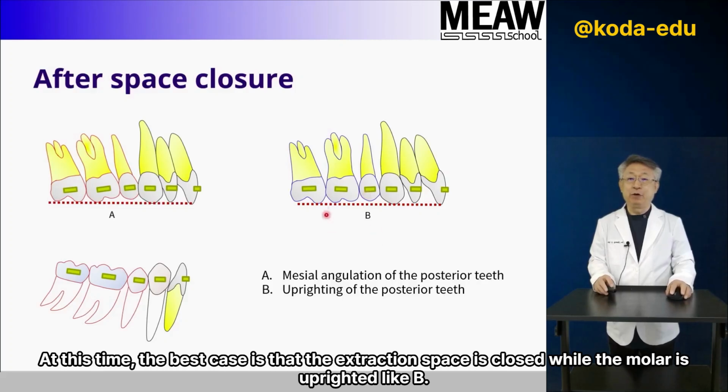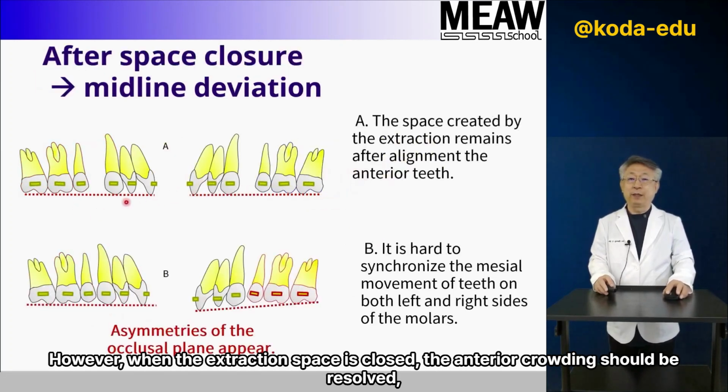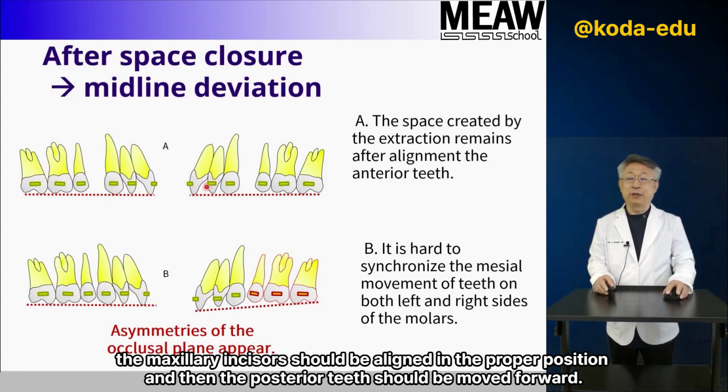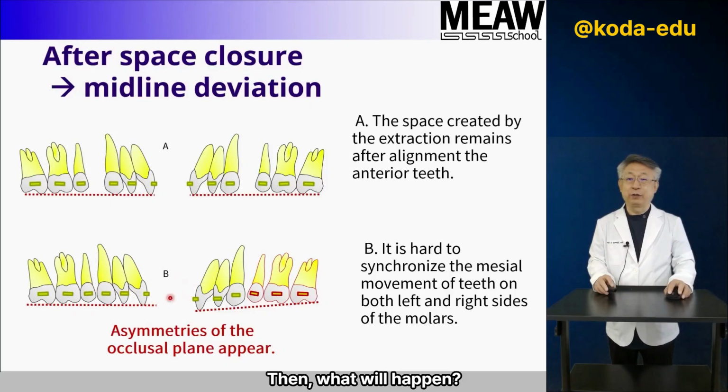At this time, the best case is that the extraction space is closed while the molar is uprighted like B. However, when the extraction space is closed, the anterior crowding should be resolved. The maxillary incisors should be aligned in the proper position, and then the posterior teeth should be moved forward. At this time, the movement speed of the left and right teeth is not always the same. Then, what will happen?